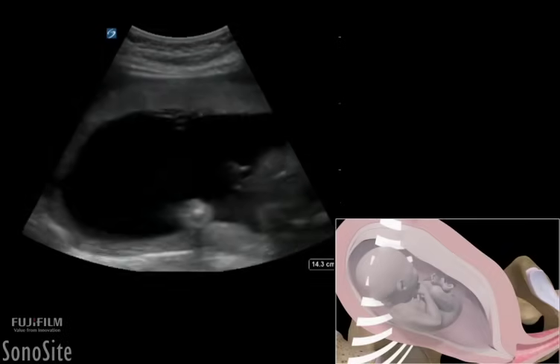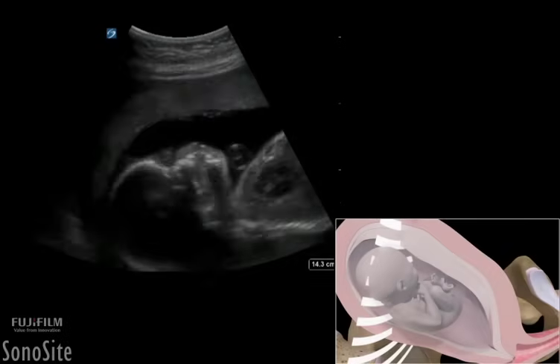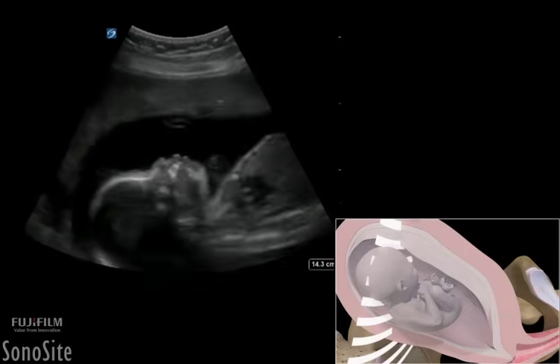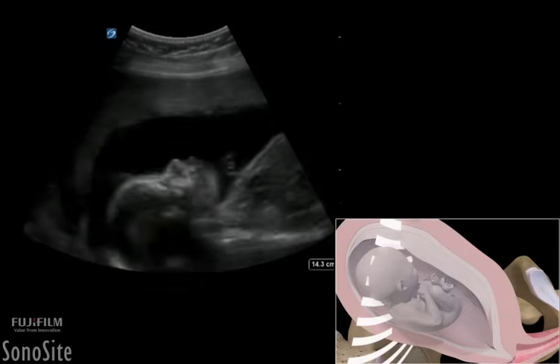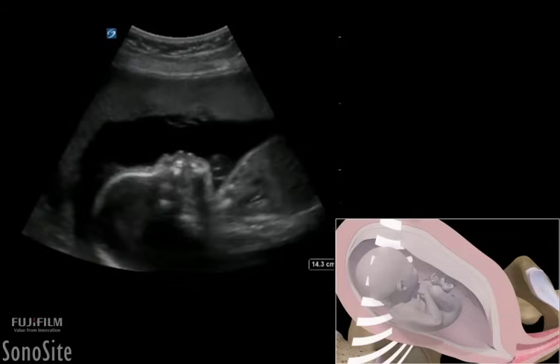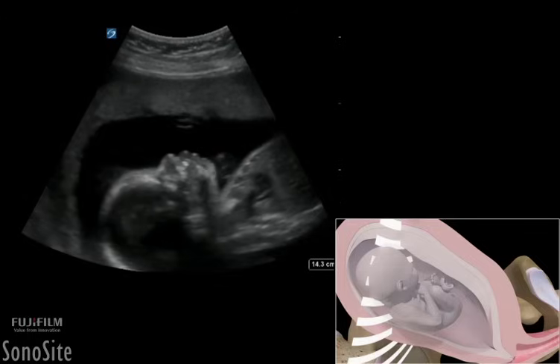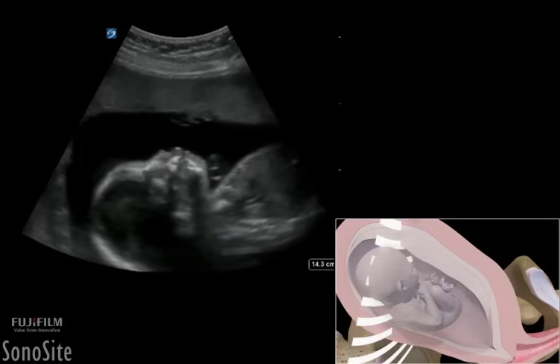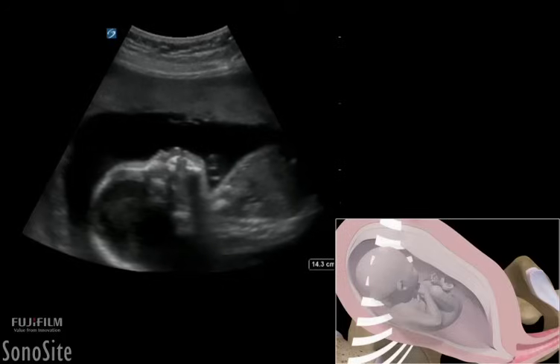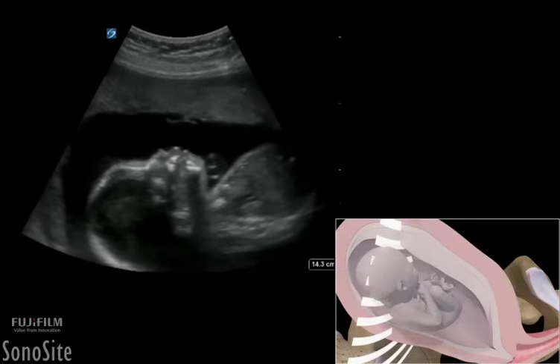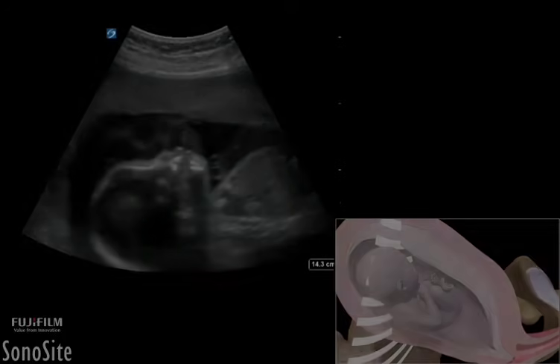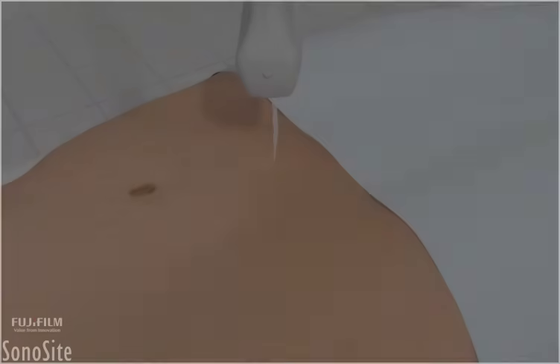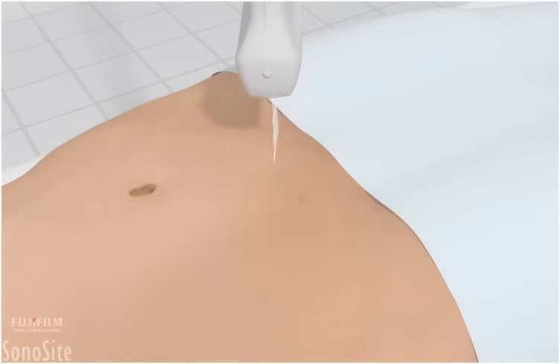A curved or phased array transducer with an OB exam type is used to perform a transabdominal examination of an intrauterine pregnancy to determine fetal weight and age by measuring biparietal diameter, head and abdominal circumference, and femur length. It is helpful for the patient to have a full bladder to complete this examination.